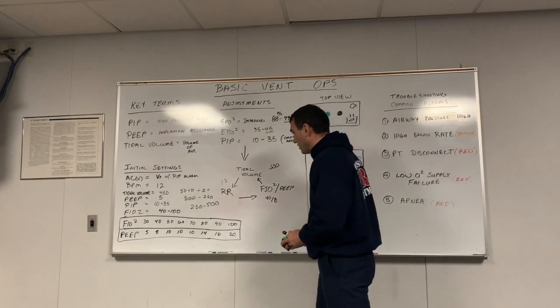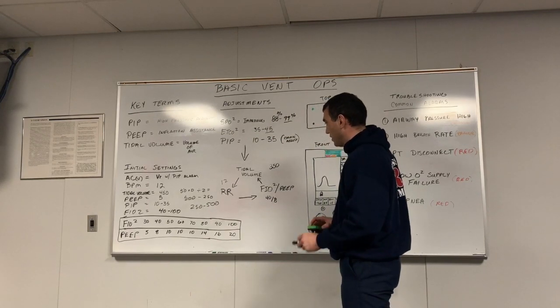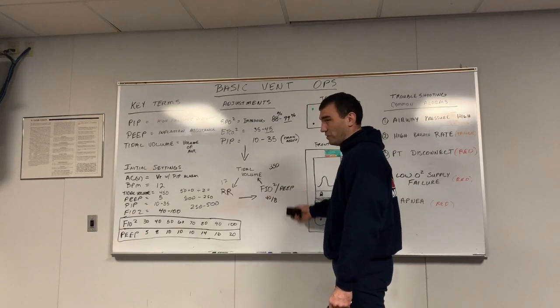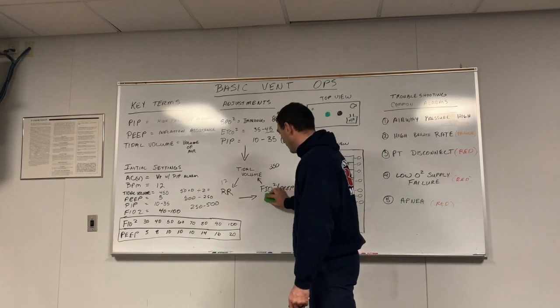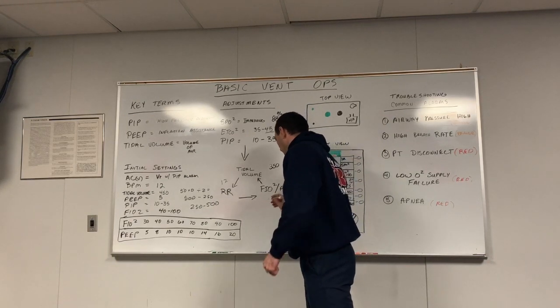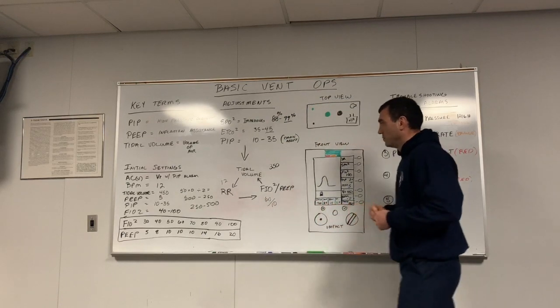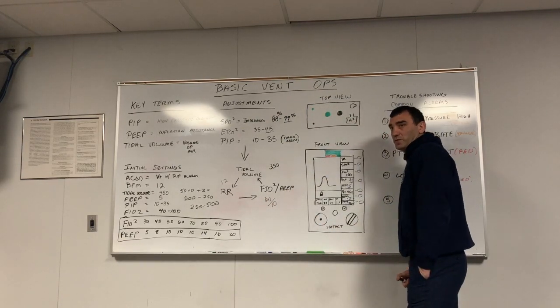The last one that I like to adjust is the respiratory rate. 12 has been seen to be a good one that has great patient outcomes. So I'm getting less volume, so let me raise the concentration of air. If I have less volume, I need more oxygen in it. So I make an adjustment, and I move to 60 and 10 off of my chart. I made an adjustment in treatment, so I go back to my SpO2 and see if my patient responds.